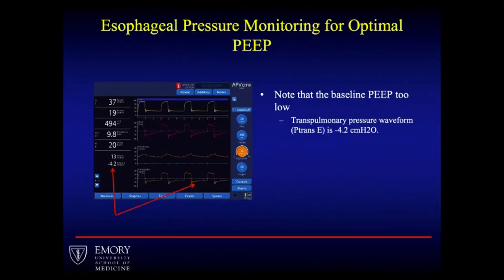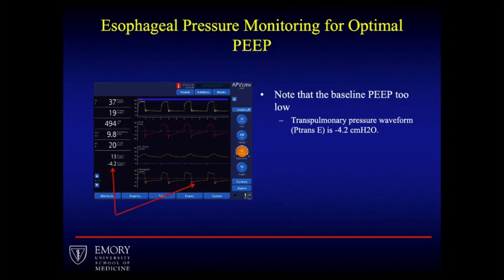On the bottom waveform, notice that at baseline the pressure waveform is below zero, and the corresponding measurement shows a negative number. In this situation, PEEP is set at 12 and you have a negative 4.2 expiratory transpulmonary pressure, which may reflect that the lung distending pressure is too low.